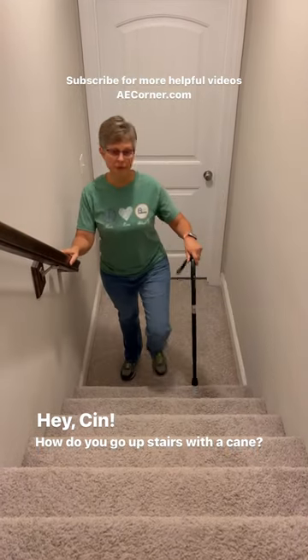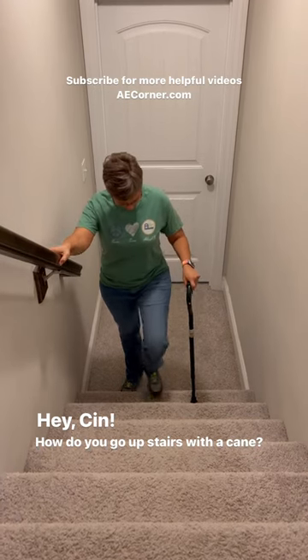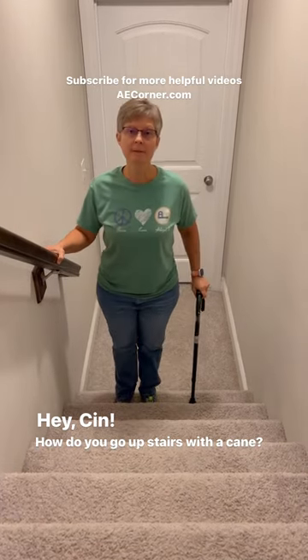Sometimes people prefer putting the cane on the step. That's okay, just make sure you're stable. Coming up with the good leg, bad leg comes up.